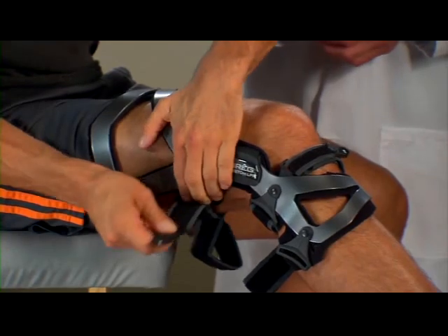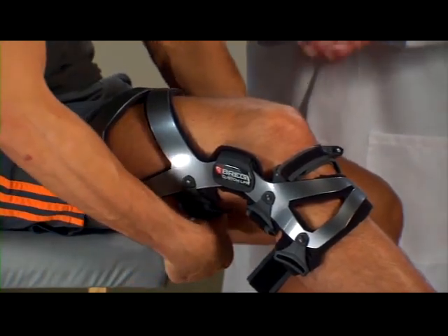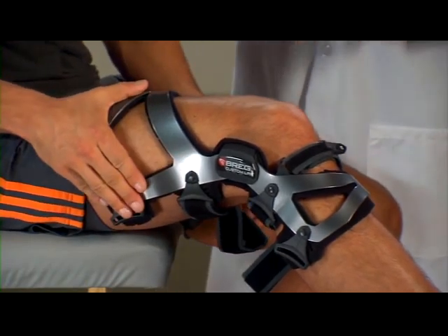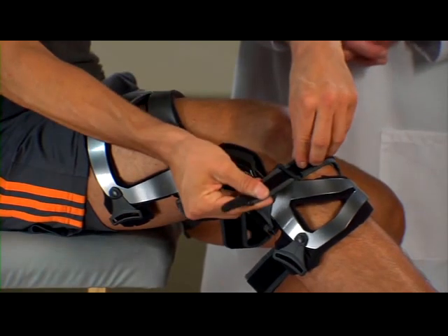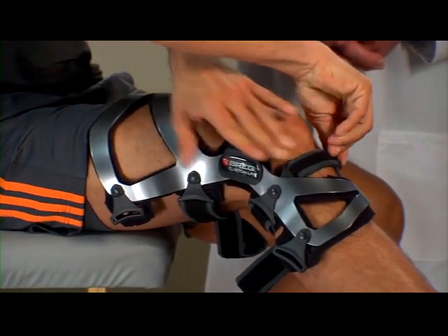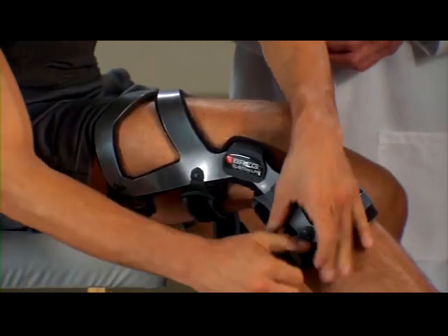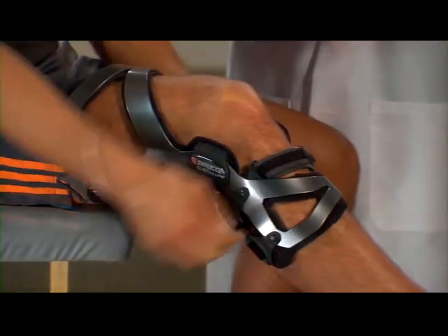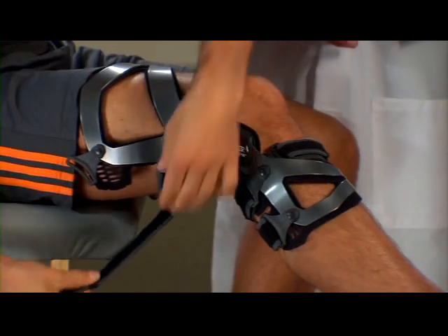Make sure the thigh cuff on the front of the brace is pressed flat against your leg and fasten strap three at the front of the brace. Next, fasten strap four in the back at the bottom of the brace. Then fasten strap five in the back at the top of the brace.